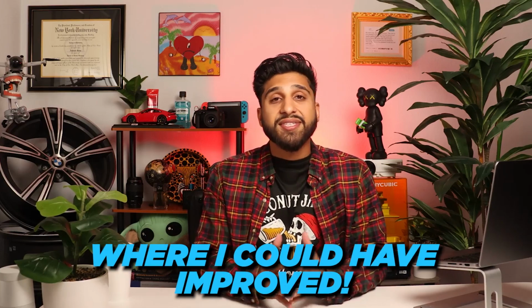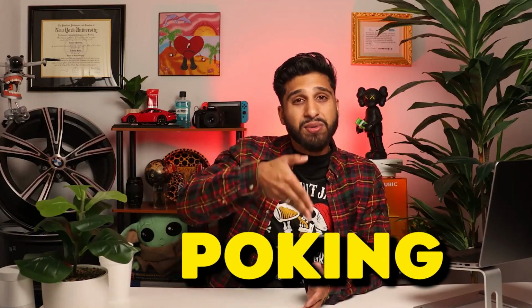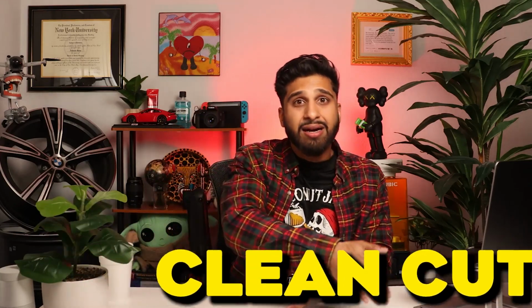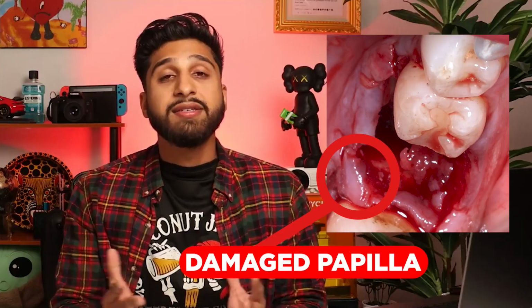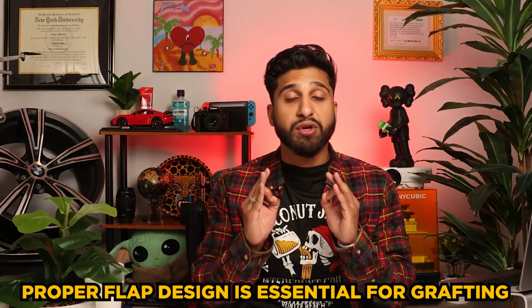Now, upon reviewing the photos of the extraction site, I noticed a few areas where I could have improved. Firstly, the flap design is far from ideal. When navigating around that second molar in the back, I didn't properly make contact with the bone. Instead, I was slightly above it, almost like poking my way through instead of making that nice clean cut all the way down to the bone. This approach caused damage to the papilla, which appears to be compromised in that area. Guys, I can't stress this enough, proper flap design is essential for grafting.